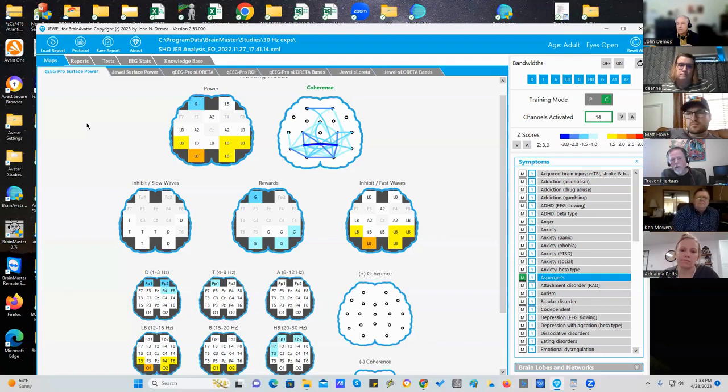So any questions on that? So John, if we're switching to coherence and then we go to QEEG Pro's sLORETA, is it going to give us sLORETA coherence recommendations? No. Let me explain.